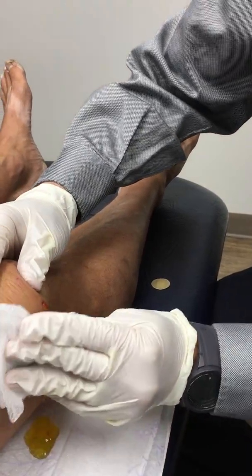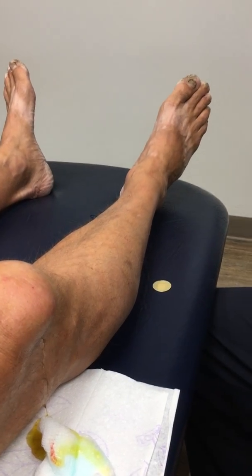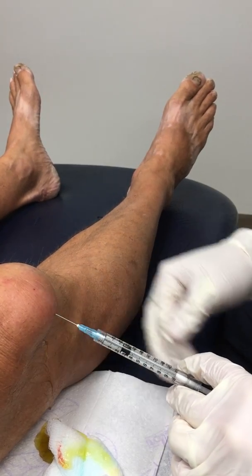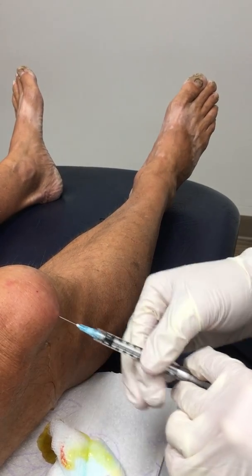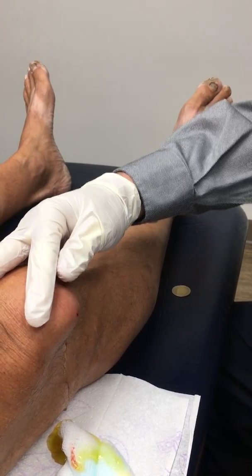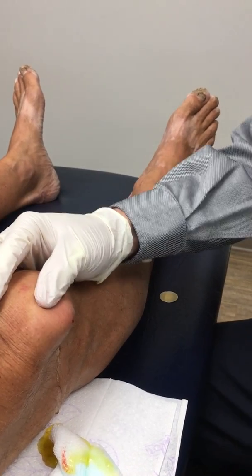And now I'm going to just kind of prep that again. And then, great, and a tiny little poke here. We're going to put a little bit of cortisone in. Good, and I'll hand that back. So that's it. You did great. Maybe I'll take one more gauze, if that's all right. You did fantastic, so we'll put a Band-Aid on that.